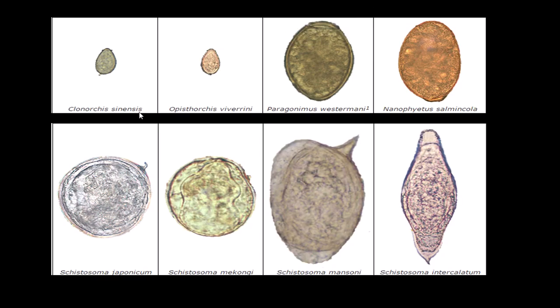So many of these worms can be diagnosed by doing stool analysis, like for example Clonorchis sinensis. This one is usually present in the liver.